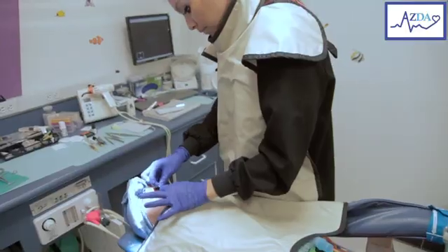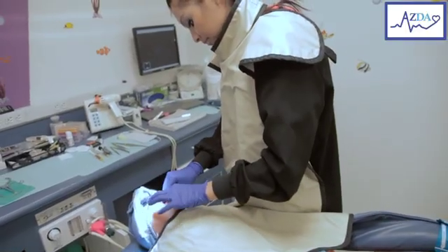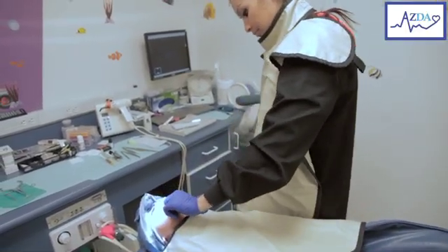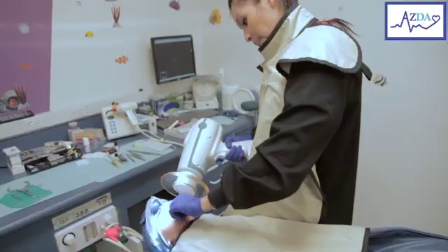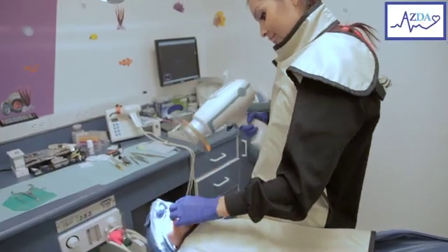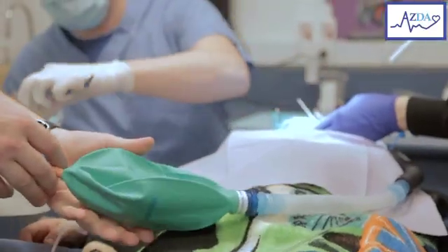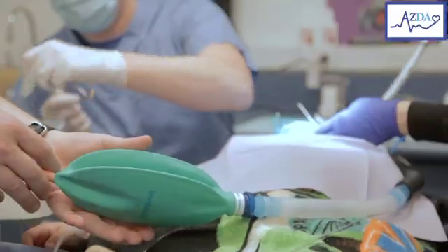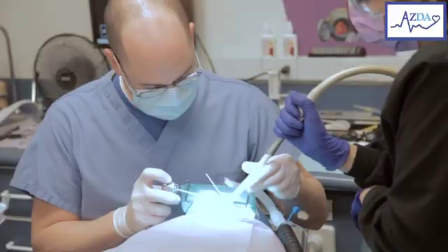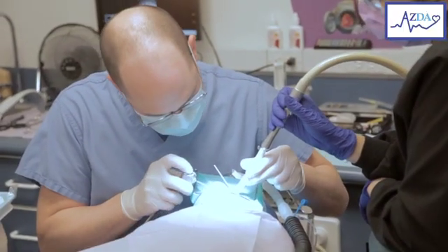X-rays can be taken before or after the patient is intubated. Sometimes it's preferred to take them after intubation due to obstruction of breathing caused by the assistant. You can now see that the dentist is working on the patient's teeth and it is very easy to breathe for the patient without making the doctor stop the procedure.